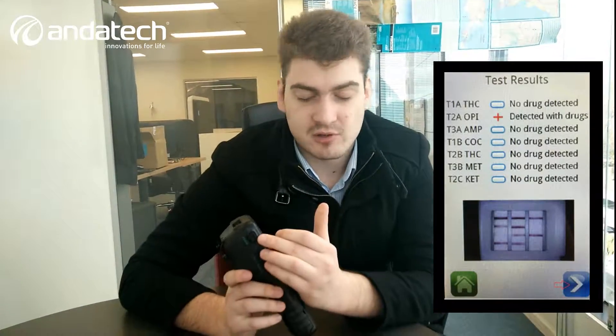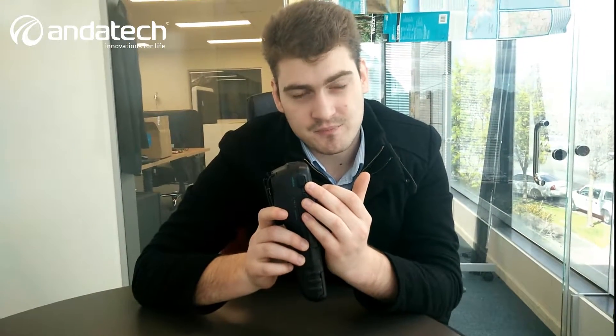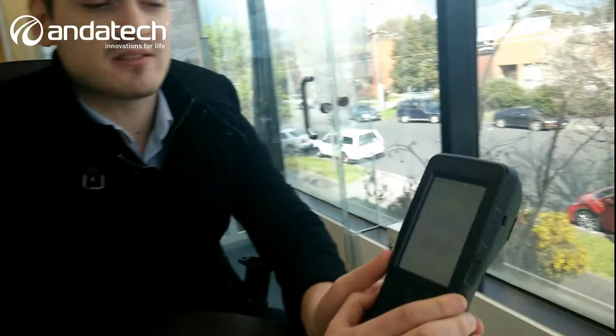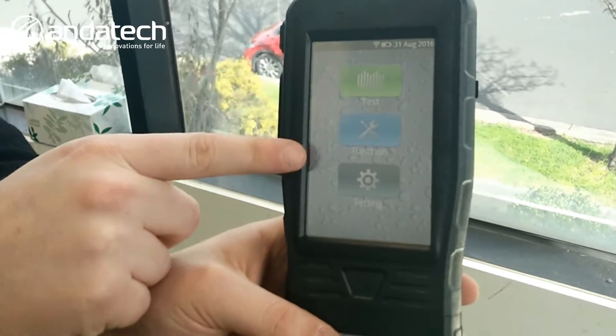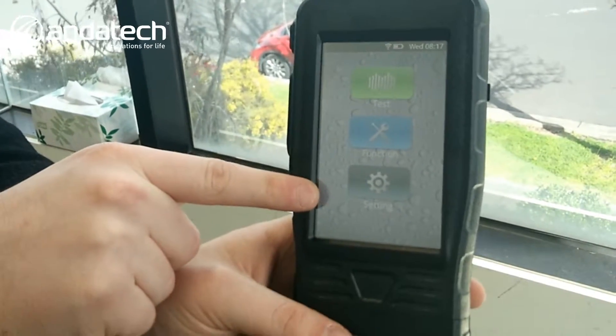Very easy to use — simply turn on the device and start pressing this button over here. It will take you to a screen requesting a password. Enter it and it takes you to the home screen. At the home screen you have the option of doing a test, picking your functions, or changing the settings.